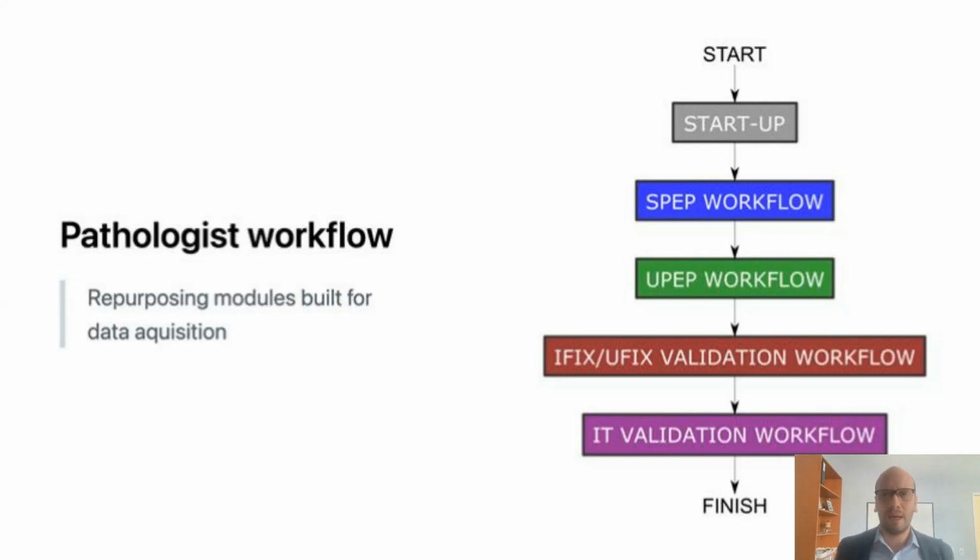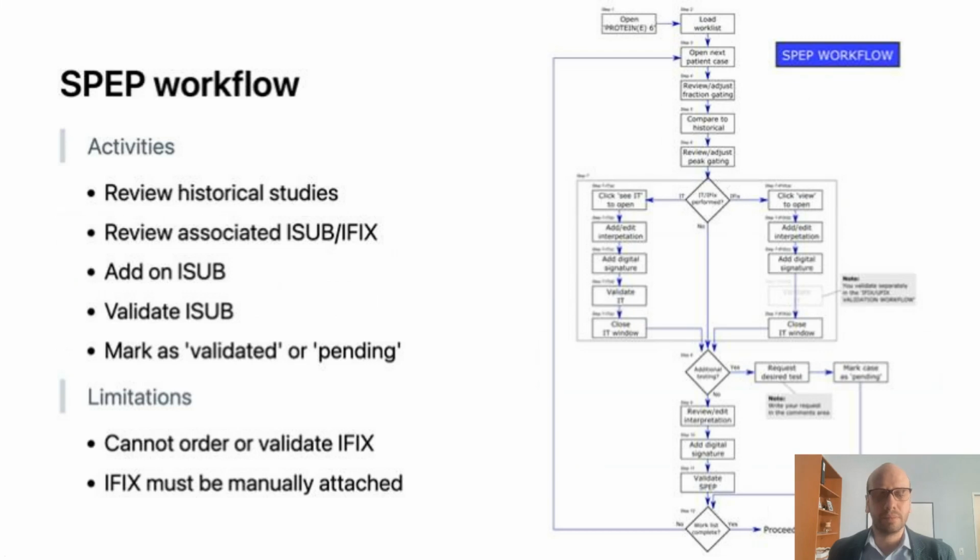So on the right, this schematic outlines the pathologist's navigation. There's a startup process. They then interpret the serum protein electrophoresis studies. This is the main activity of their day. They'll then view urine protein electrophoresis, validate immunofixations, and then validate any immunosubtractions. So the SPEP workflow, this is, again, most of the time the pathologist spends. And so I'll just outline quickly this process, and then the subsequent ones will be pretty similar.